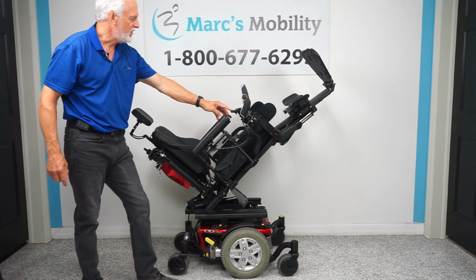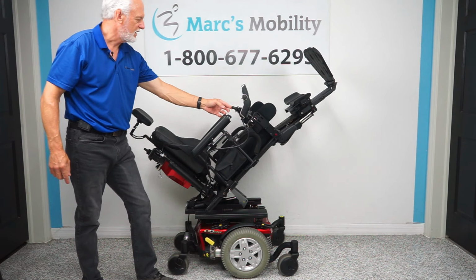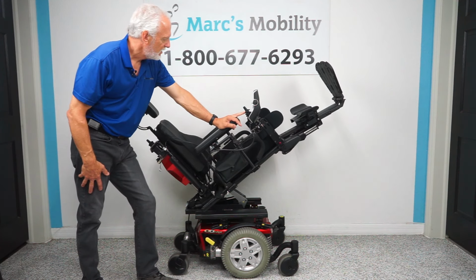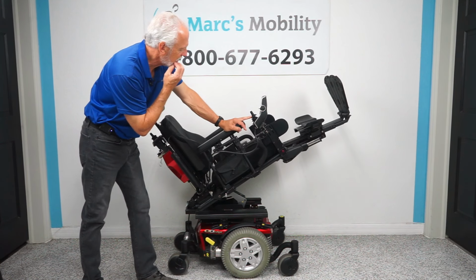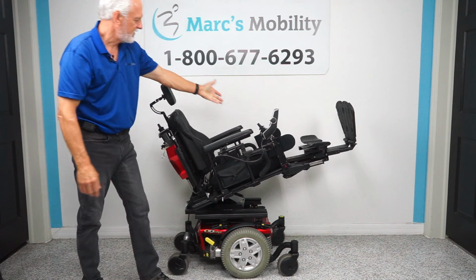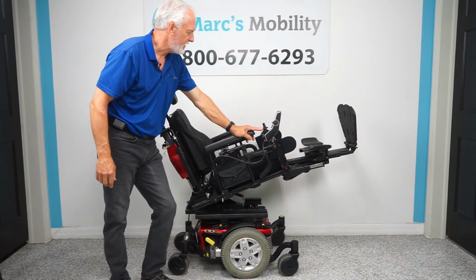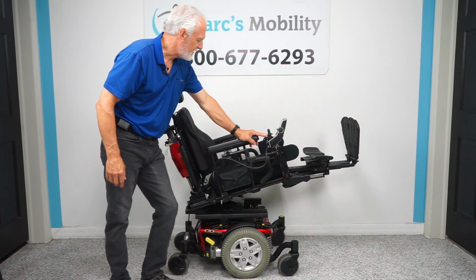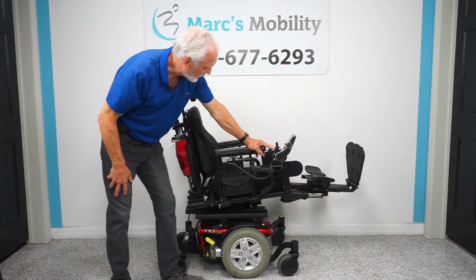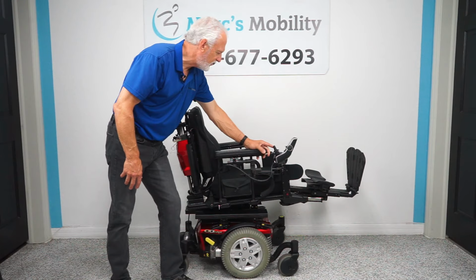Look at this, folks. If you need some circulation, look at that. That's a little extreme. So let me bring the seat back down. Even if you're halfway tilted, you would still be able to get your feet higher in your body. So right here, you can still see you're higher than your body. Okay? I'm going to bring the seat back down to almost flat. There we go.